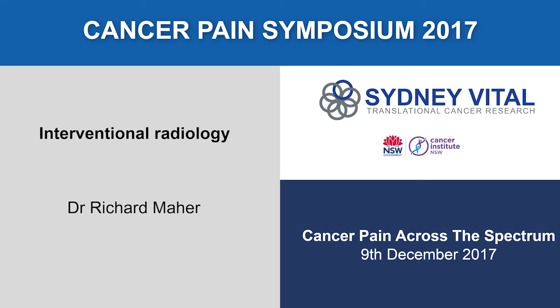So this is just showing going to the epidural space there. And this is a patient with an RCC met who's got epidural extension of the tumour. So this patient had a lot of pain. They needed some form of treatment stabilisation. So they actually had the procedure done, but they had it done with intrathecal contrast. So the operator here has done a myelogram, put contrast in the thecal sac, so that he could see if there was any movement of that, he would then stop and not put his cement in anymore.